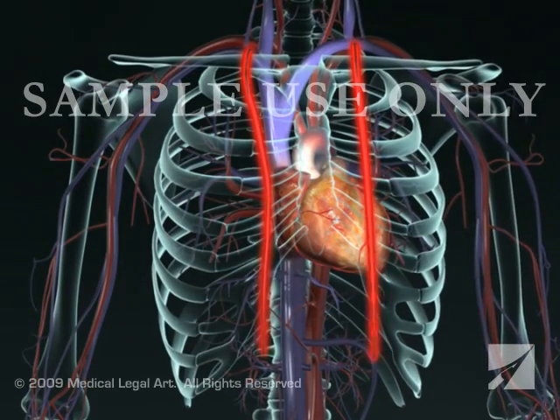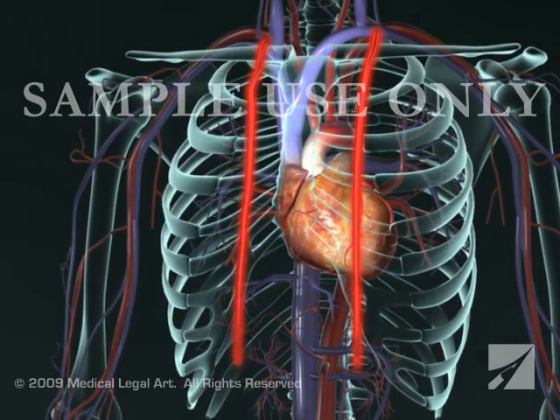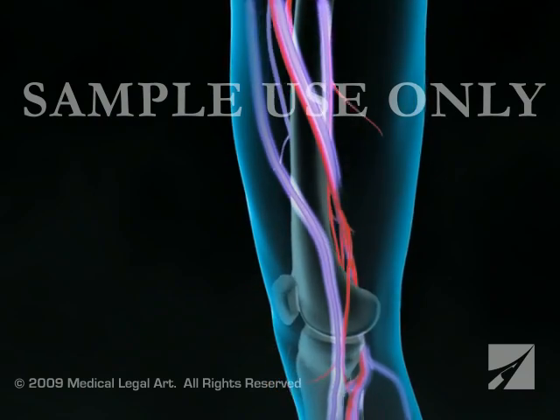One of two blood vessels is typically used for the grafts: the internal thoracic artery in the chest or the saphenous vein in the leg.